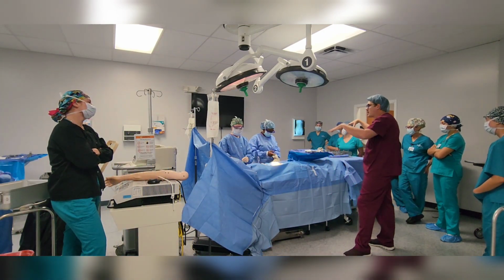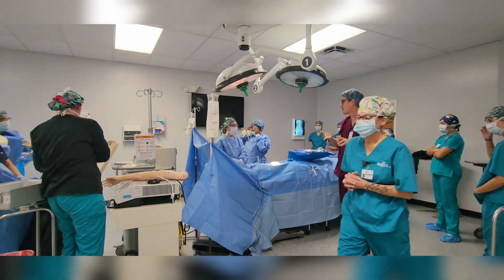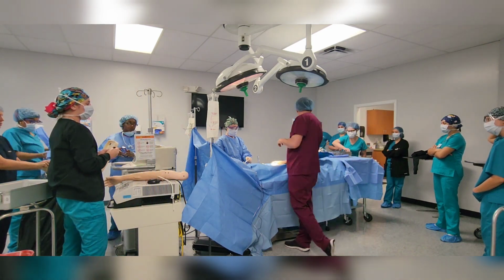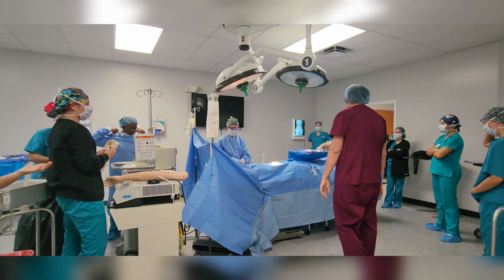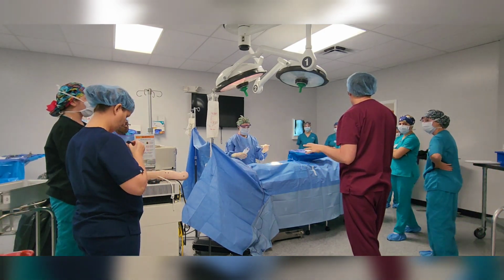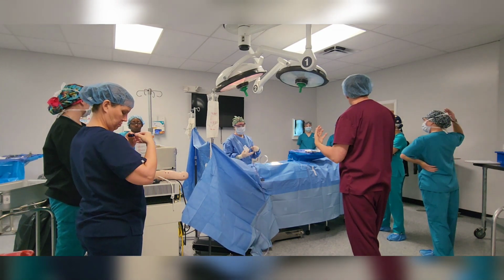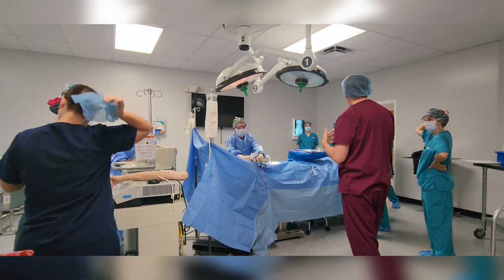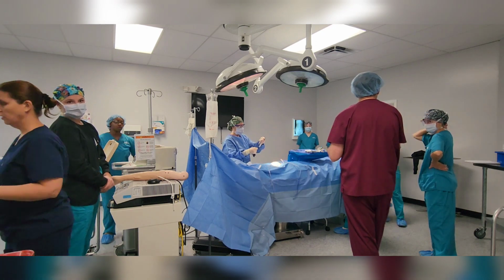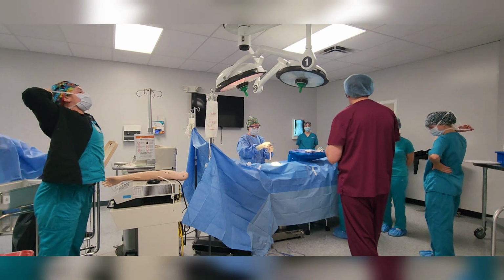Anything that you did not have in your packs, you didn't have any light handles, you didn't have any laps or Raytec, make sure you have them in there, right? Because that'll help you out. If you remember, I gave you that setup, but they didn't have it, so I put a variety of things up there. But in the future, do some research on the appendix, what goes on a mayo. I would say have it written out, so when you're ready to set up, stick it on the wall and set it up. What goes on your mayo? Three hemostats, whatever. You're going to go down the list and just throw it up there.